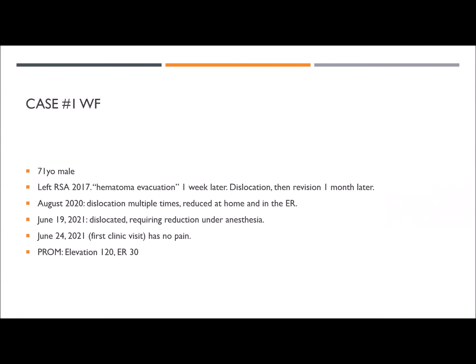Dr. MacQueen, we do have a question coming from the chat. What is your postoperative protocol for rehab activity modifications and weight-bearing progression for reverse TSAs? Okay, so great question. Again, with some of these designs, the early Grammont design, the recommendation is to fix the subscap.